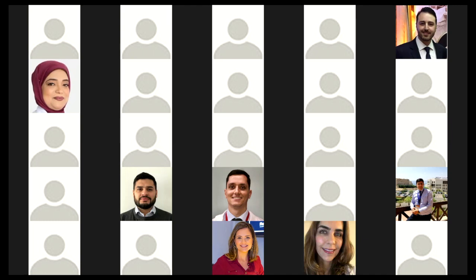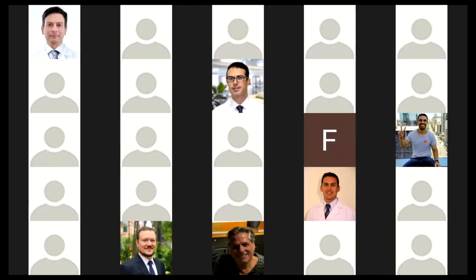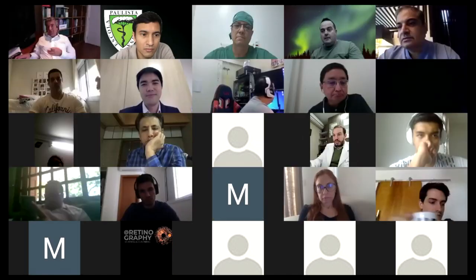In fact, I have done this with a plate haptic like Oculentis Comfort, and I cut the haptic in order to create four independent haptics in order to make diagonal optic capture. So this is a maneuver that can save a lot if you have an intact capsulorhexis, as in this case. Well, that's a very interesting technique you just described, Dr. Lukan.